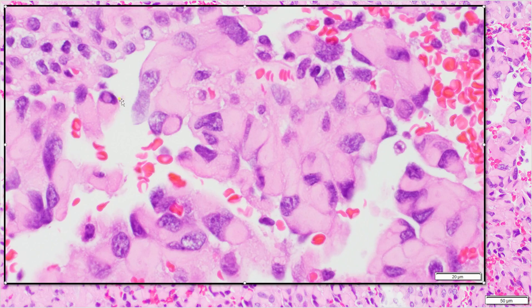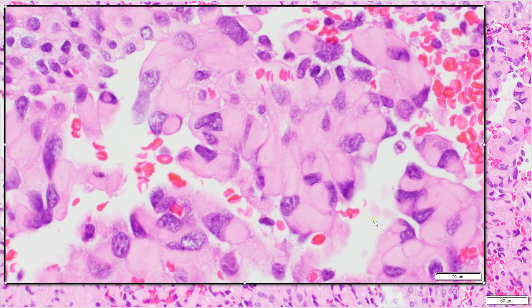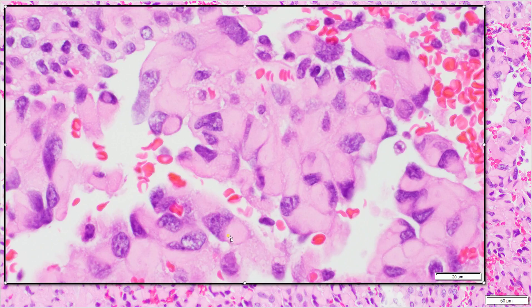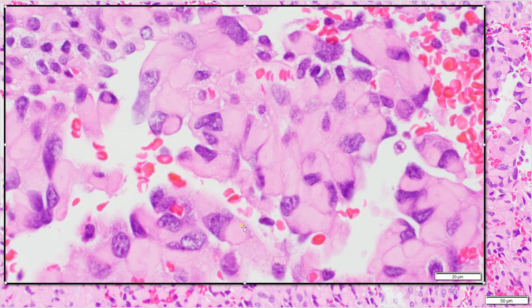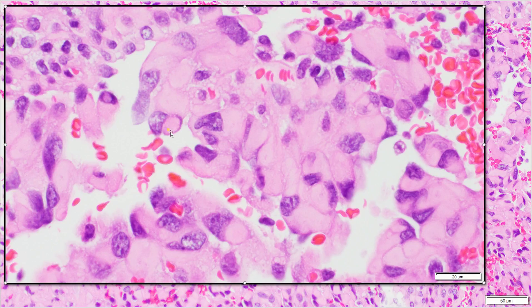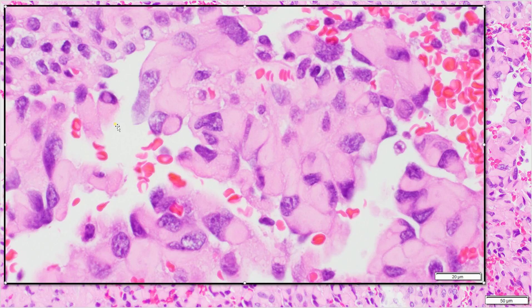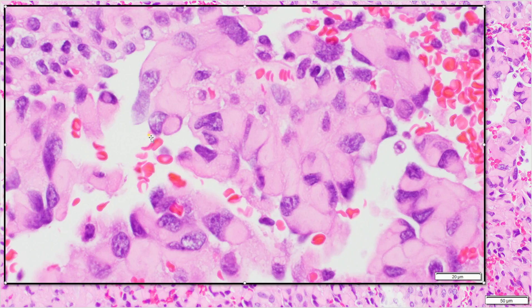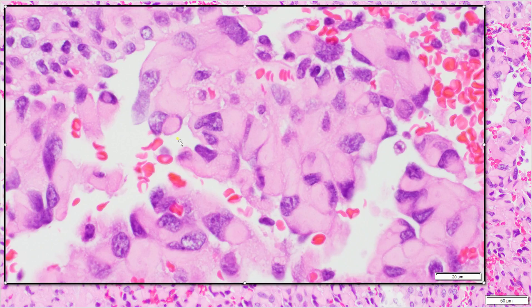We can see pretty prominent cell borders here, and we can definitely tell where one cell ends and the next begins. Notice how these cells look like they have little pregnant bellies hanging off of them — as if looking down on the head of a pregnant woman where the nucleus makes up the body and head, and you see the belly sticking out. These are little cytoplasmic inclusions that look very odd and different from what we saw before. This is a classic rhabdoid appearance, where the nuclei are pushed off to one side and the cytoplasm looks like it's full of protein or some sort of material.